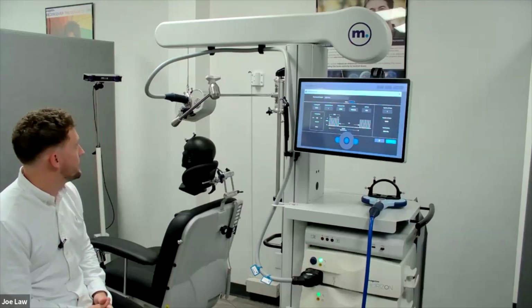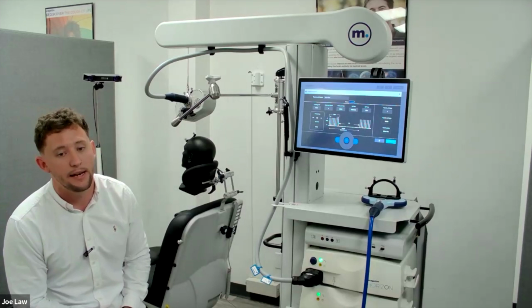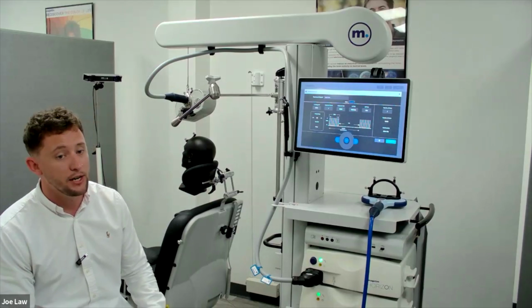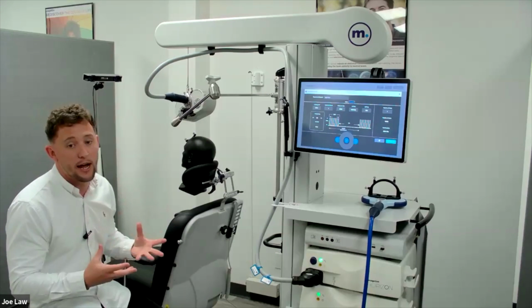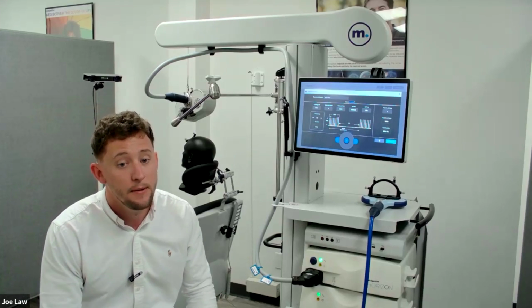Great. Another question: how loud is the air-cooled coil, particularly for OCD treatments? That's a great question, and it's kind of down to the clinic itself. As long as you stay within our operating means, which is around 72 Fahrenheit ambient temperature or less, the fans usually stay pretty low. If you have a warm clinic environment, those fans are going to need to work more to bring more air in to cool the coil down. So as long as you stay within our operating temperatures, that fan should not be loud.